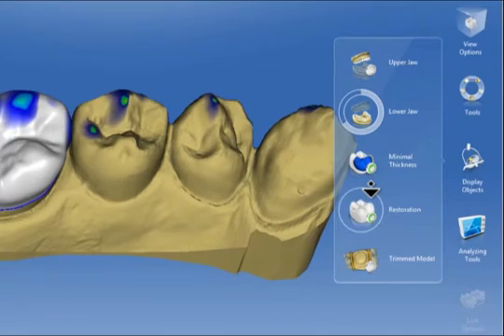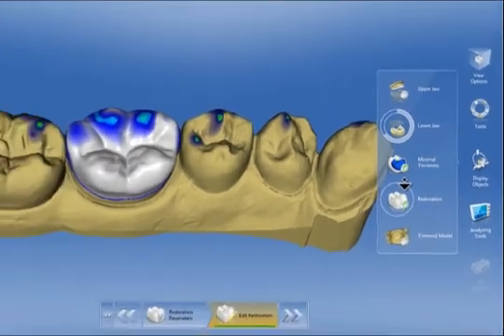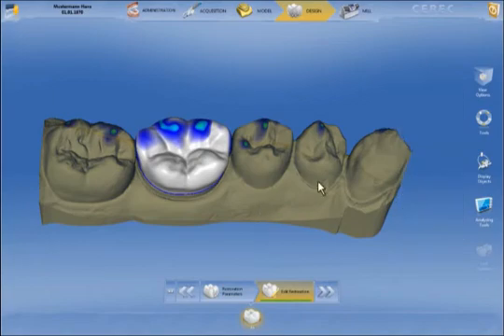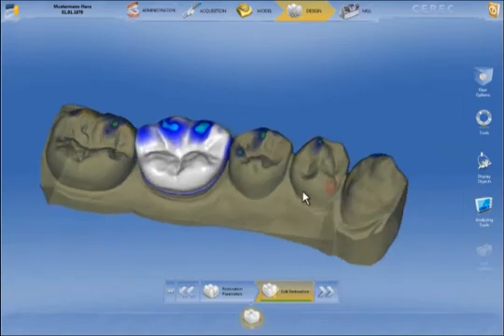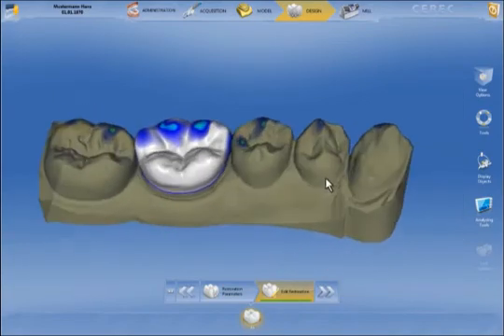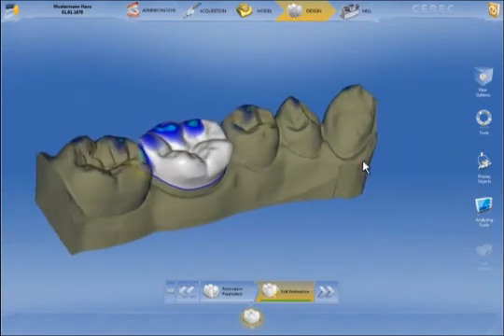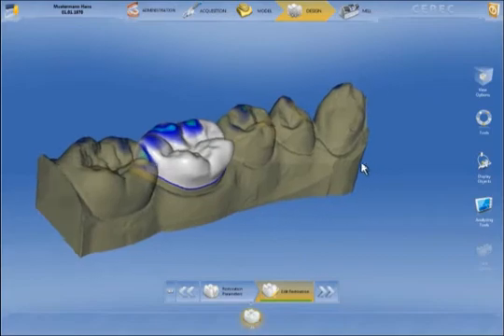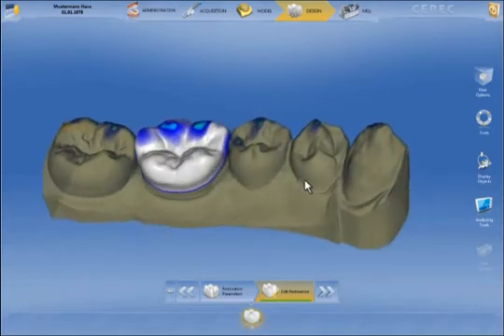We click on the lower jaw model, hold the left mouse pressed and drag down to increase its transparency. This makes it easier to assess the proximal contacts.